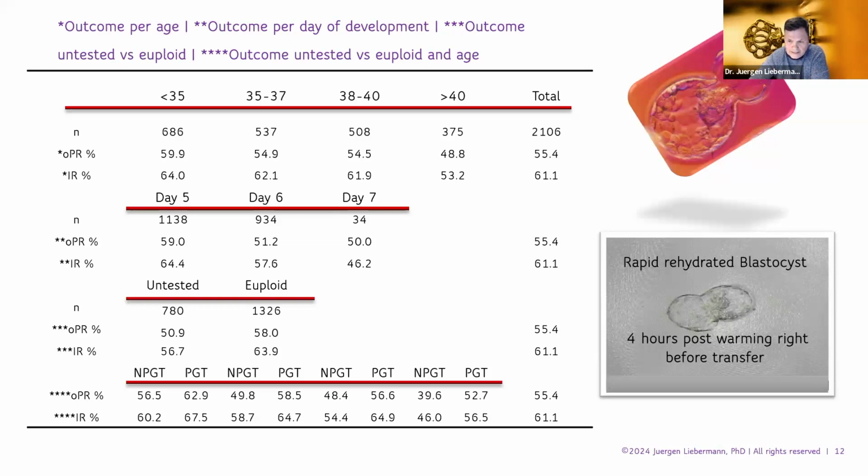The picture on the right is a blastocyst we rehydrated for 1 minute, and we usually do transfers 2, 3, or even 4 hours later. In that case, was it 4 hours? We kept it in culture until transfer.